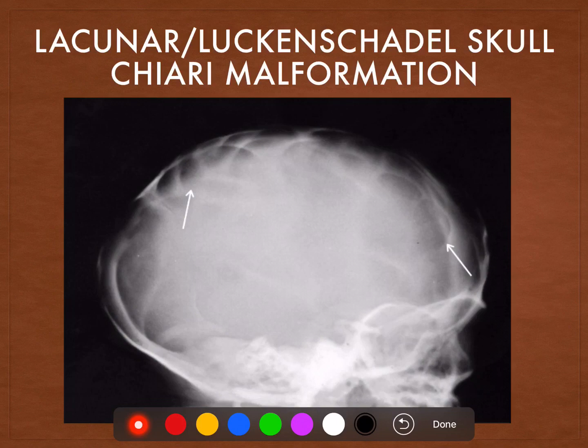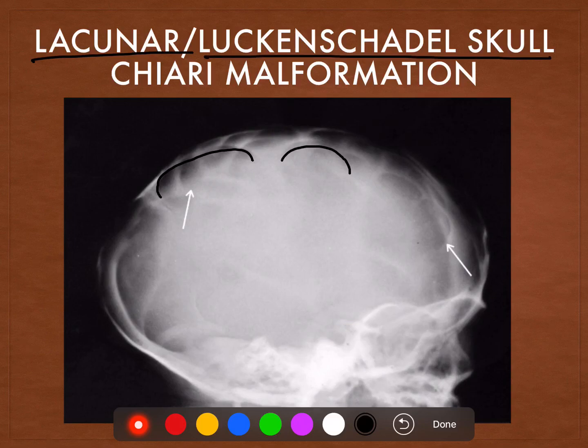Here we see well-defined radiolucent defects in the skull of a young child and this is known as the lacunar skull, or the lückenschädel skull, and this is characteristic of Chiari malformation. The bone is actually dysplastic, and this dysplastic bone of the skull is seen as multiple large radiolucencies in the skull.